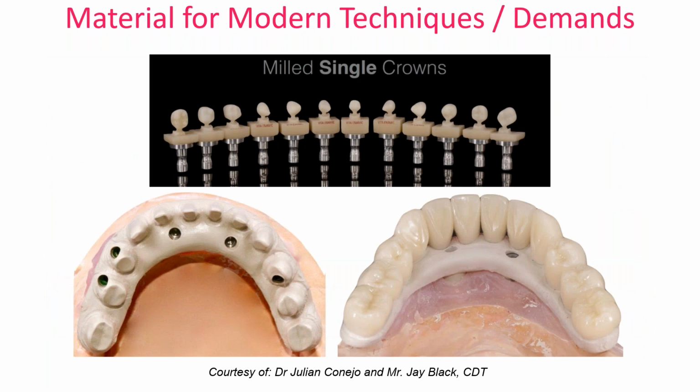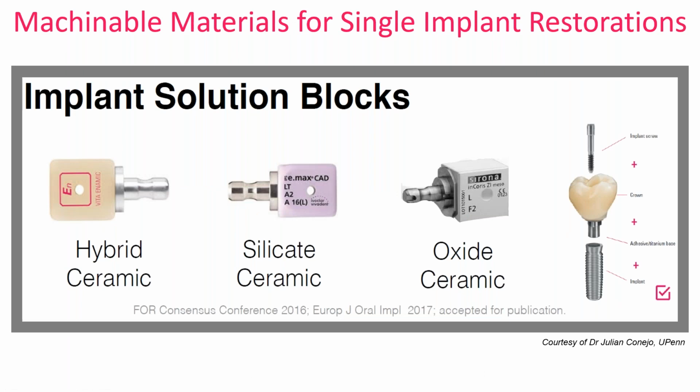This happens to be Enamic, but newer materials are coming out on the market. This happens to be a PEEK type material framework. These are Enamics, but they work out well. Or no metal, metal free. They want something more natural. Everything blends in, with compatibility between the bonding of the framework posts and the restorative material. It's clean, it's nice, and it's long lasting.